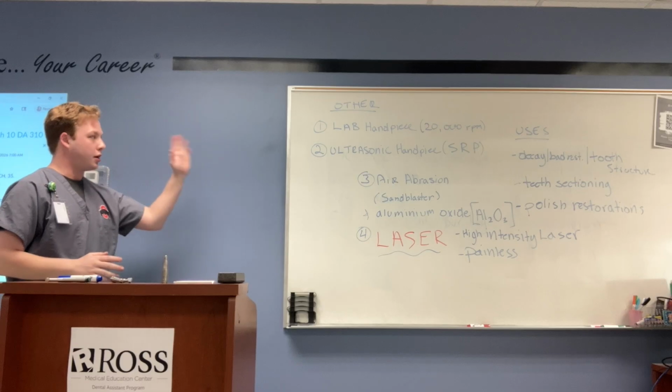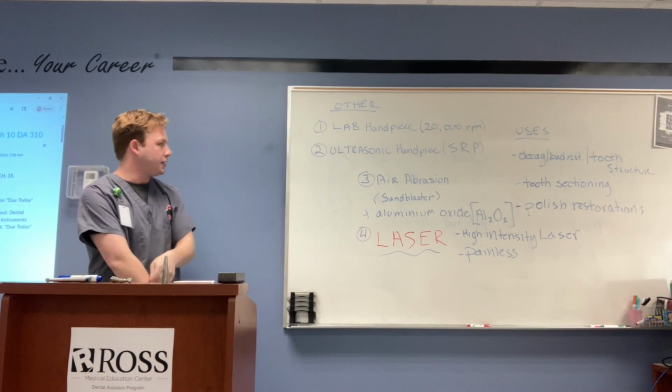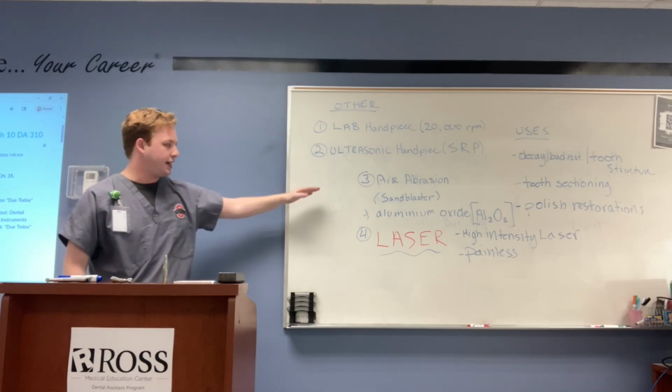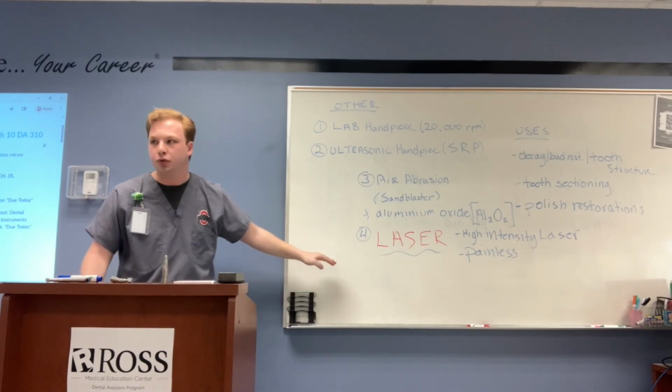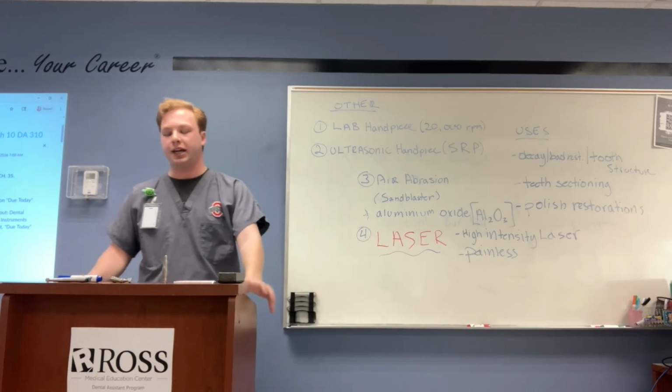So those are our handpieces. The two you'll see, depending on where you work, are the lab and the ultrasonic. And then depending on what your office does, you'll see air abrasion or the laser handpiece. Okay?